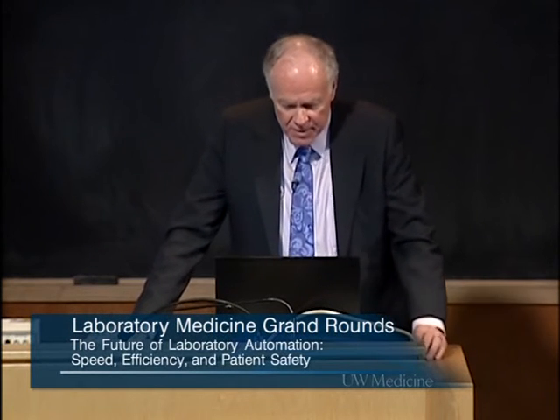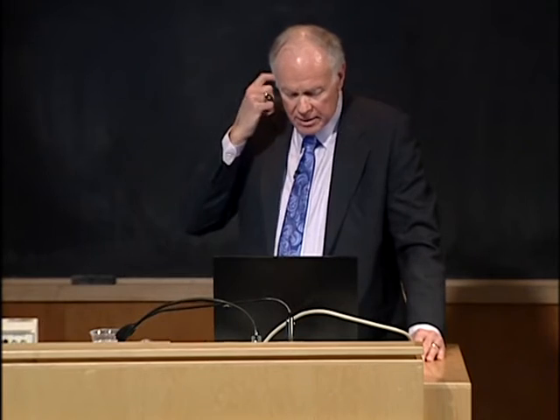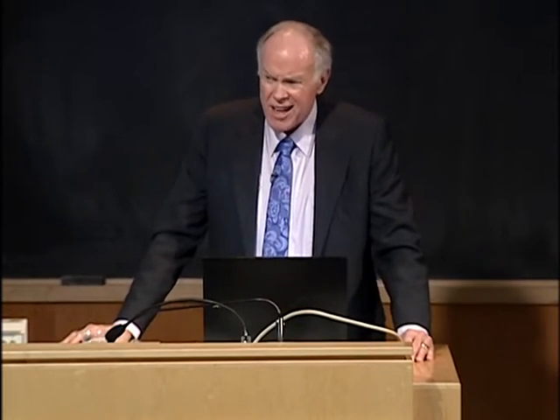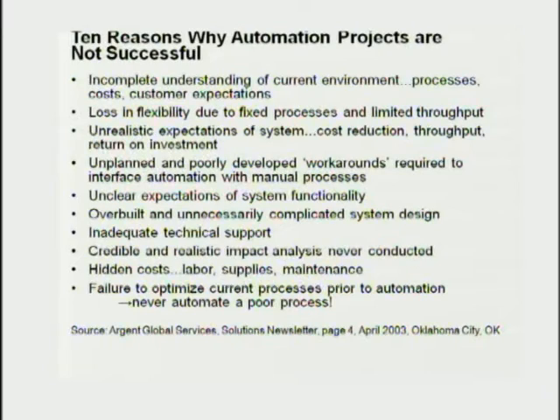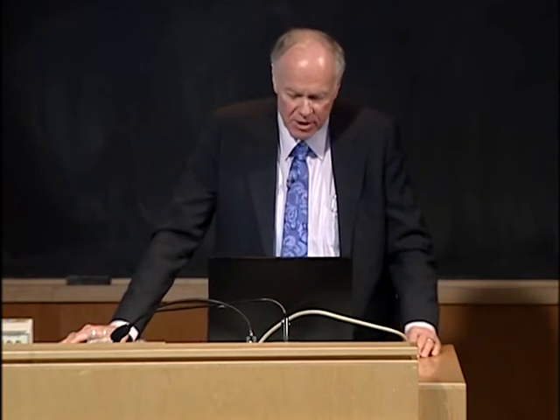So let me conclude this part of the talk with a slide that I borrowed from a consulting company called Argent Global Services. This is not a David Letterman list, but sort of like that: top 10 reasons why automation projects are not successful. Too often, laboratory managers just don't have a complete understanding of what their current environment is, the processes, the costs, customer expectations. And so that creates a false understanding of what they might expect out of an automation system.